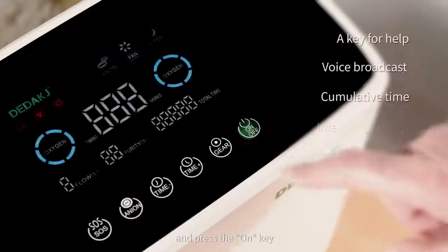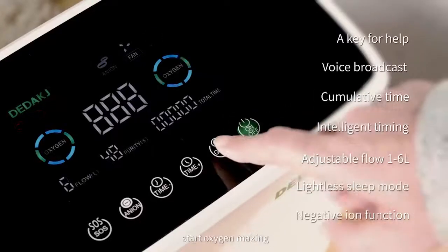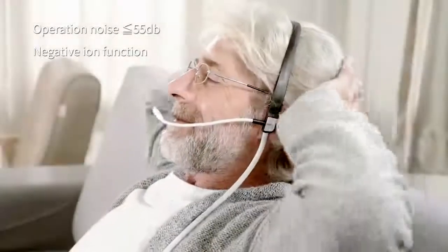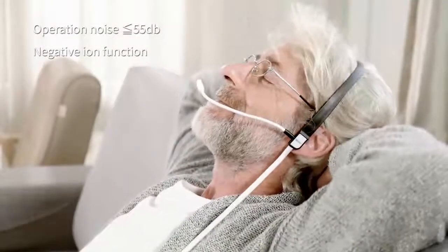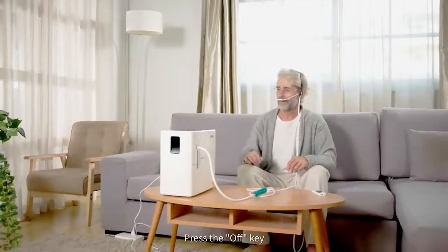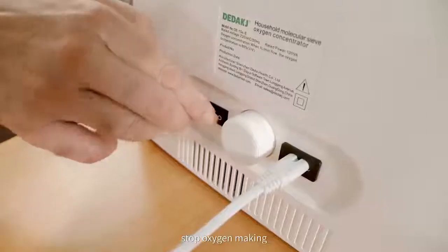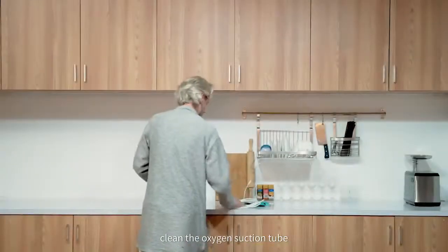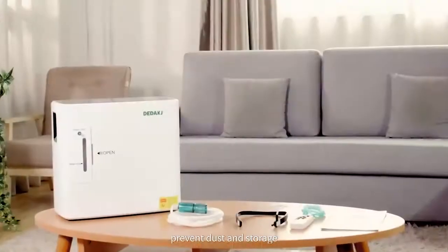Turn on the power switch and press the on key to start oxygen making. Press the off key to stop oxygen making, then turn off the power switch. Clean the oxygen suction tube to prevent dust, and store properly.